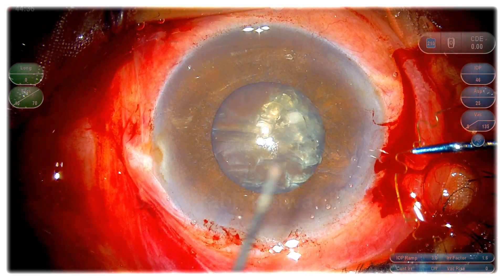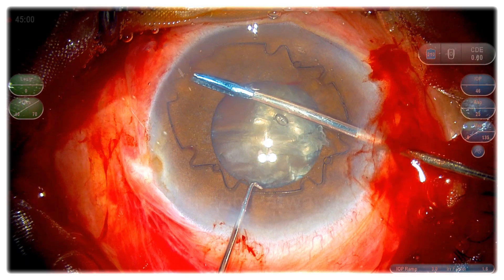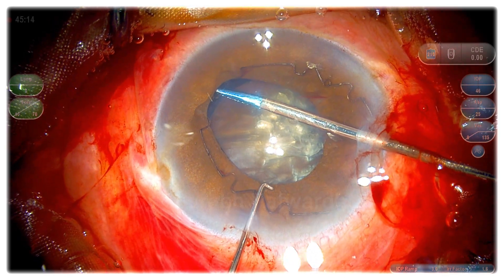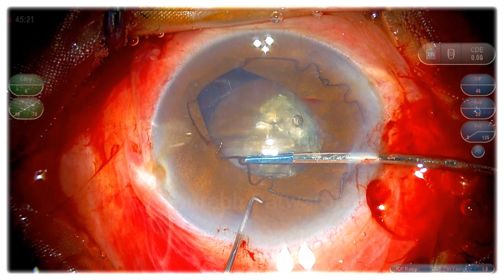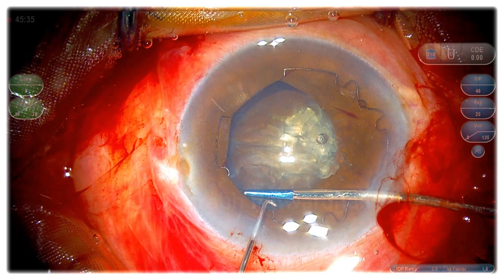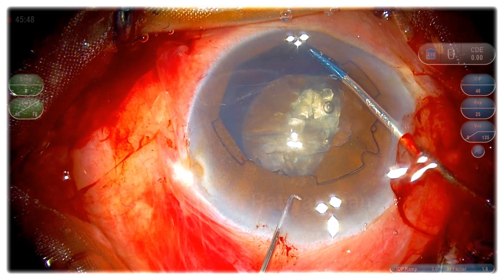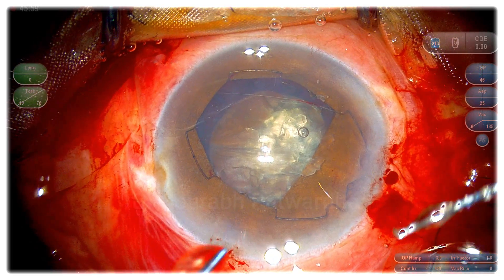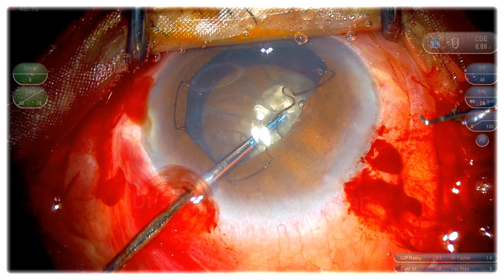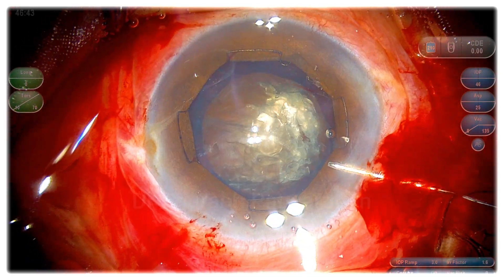I decided this is the right case to do it. I have already done the capsulorhexis, and many people feel that putting this ring after doing capsulorhexis is difficult — but it's absolutely easy. You just have to be careful when you put those flanges. You can see it has 8 flanges; 4 go below the iris. As I am pushing, I generally push it a little away and lift it slightly so that the capsulorhexis margin doesn't get engaged. I can actually watch the capsulorhexis margin and confirm it is free. The 3 flanges I can put under the iris right from the main incision. And for the last flange that goes under the incision — I love this because in B-Hex I had to drag that third flange under the iris in the sub-incisional area, but here because we have 4 flanges, one flange will always come under the incision, which makes it very easy later when we implant the IOL. Large pupillary expansion — this is what I wanted.